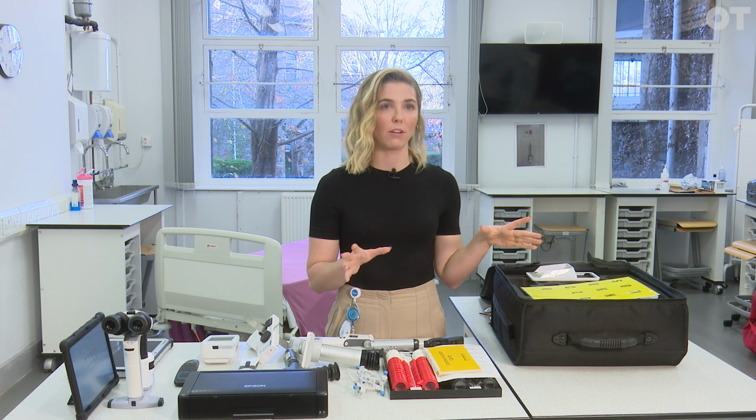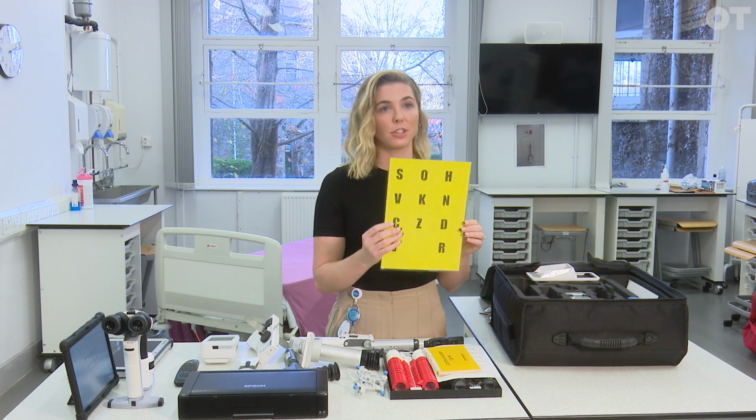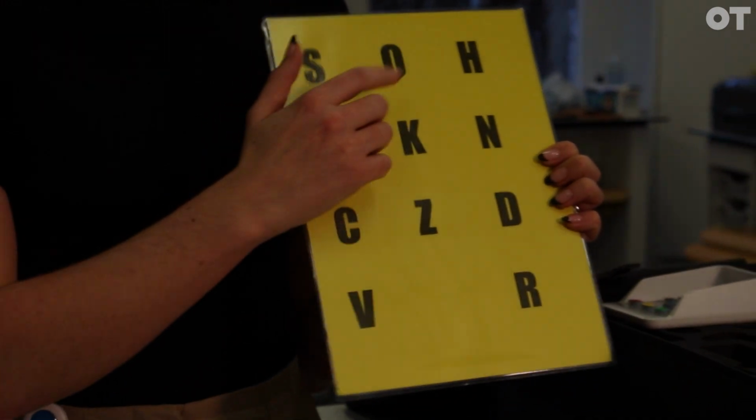We will quite often use matching charts with our patients if they've got any communication issue that they can't interact with us as easily. These are often really useful if you've got someone who's non-verbal because of learning difficulty, or if they don't speak English. They can obviously just point to these.